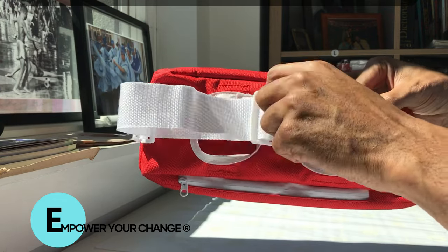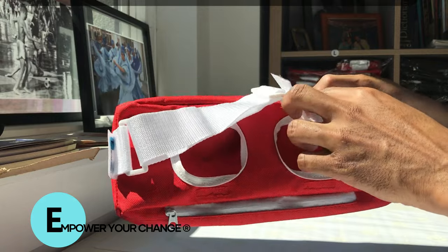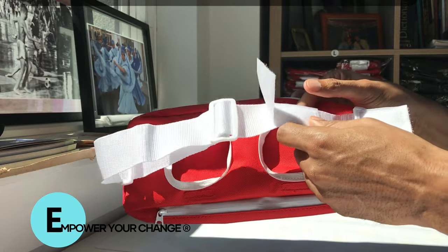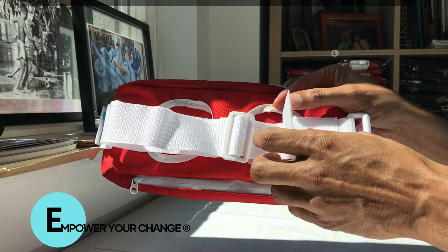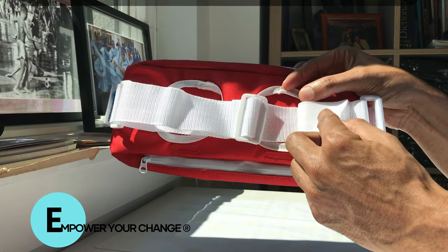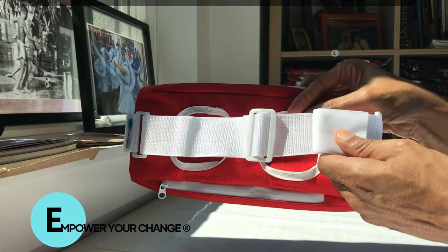It's designed not to let it slip off, so it features a two-lock system. Once you put it on, you lock it on one end and then overlap it a second way. This keeps it very secure.